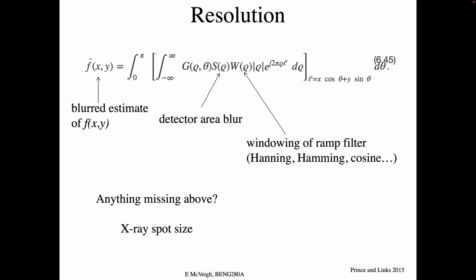And so you can imagine that if I have a dot and I image the dot and I say, what does the dot look like from X-rays in the top corner of my rectangle? The dot's displaced in one direction. What does the image look like from the X-rays in the other corner of my rectangle? It's displaced this way. So there's a spreading, a convolution, as it were, of the sources, right?